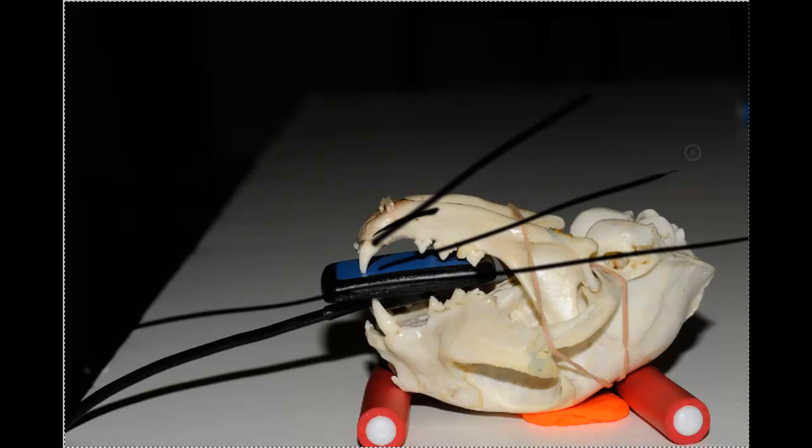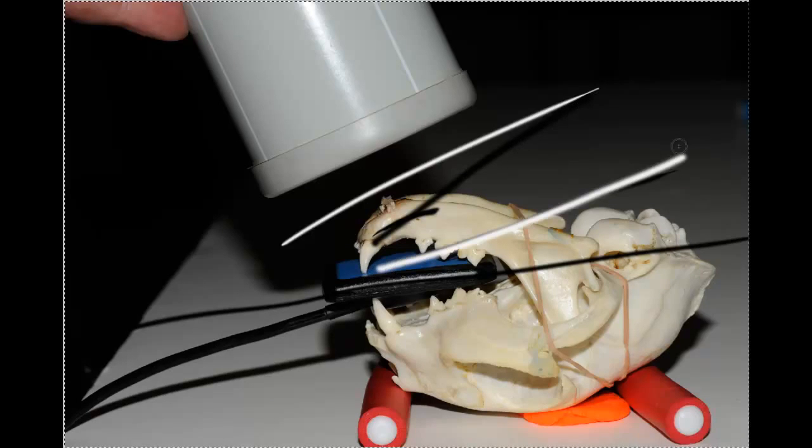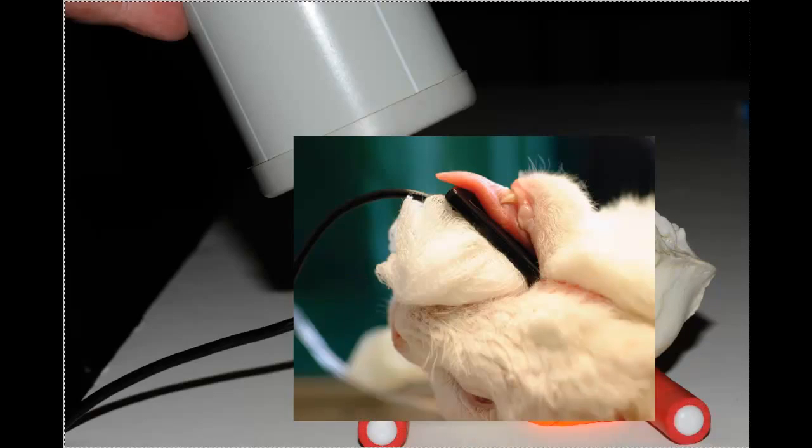So, we can see that we're really going to be looking almost parallel. This is a near parallel technique. And again, here you can see where we are pretty much parallel to that.